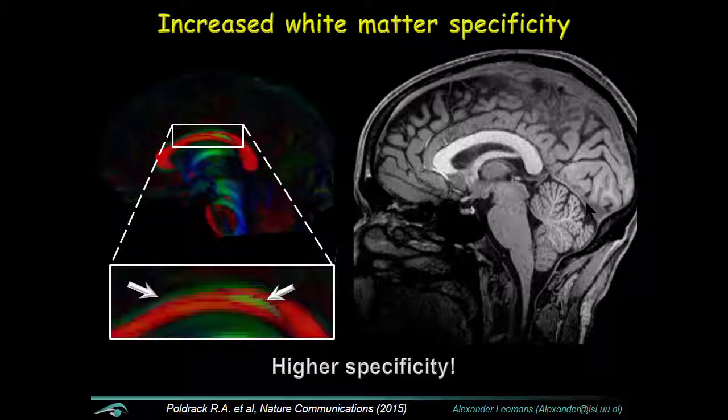I just asked Chris Hess to have a look at this as well. He couldn't see anything. He told me that this top structure is not abnormal to observe, but this middle part clearly is. And then you may argue, well, this is a healthy subject. This is an accidental finding.